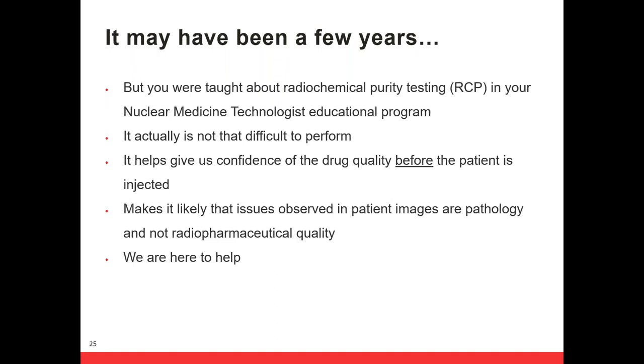You made it simple. Your department management system should also make it as simple for you as possible. It's not that hard, right? Rich went through it. I mean, he broke it down into a couple simple steps. It's essentially break it down into those simple steps and perform it. You should be doing it every time. Why do we do it, right? The ultimate goal of why we're doing it is to make sure we're giving a pure drug to the patient, right? Because at the end of the day, what we really want is to be able to image the patient's pathology rather than question whether it was radiopharmaceutical quality, right? If what we're seeing on the screen is actually something that we should be concerned about, or is it something because we just didn't perform that QC, we're not 100% confident that we're absolutely ready to go.